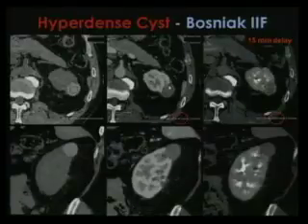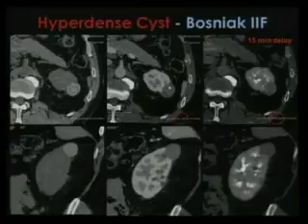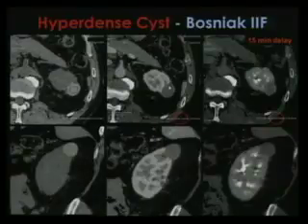Why can a cyst be so dense? Because it contains hemorrhage or proteinaceous material. That's why it's very important to have a full protocol.